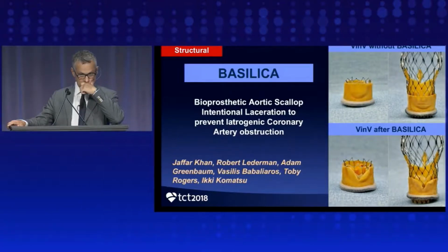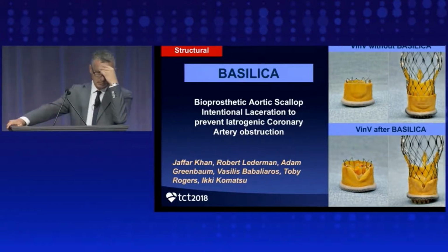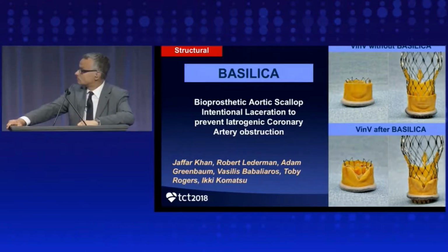So we'll go through the BASILICA technique in detail during the procedure itself. We didn't want to run a presentation now, but basically it's a technique of bioprosthetic aortic scallop intentional laceration to prevent iatrogenic coronary artery obstruction, in which we lacerate transcatheter a leaflet in order to enable flow towards the sinus and to prevent coronary obstruction.